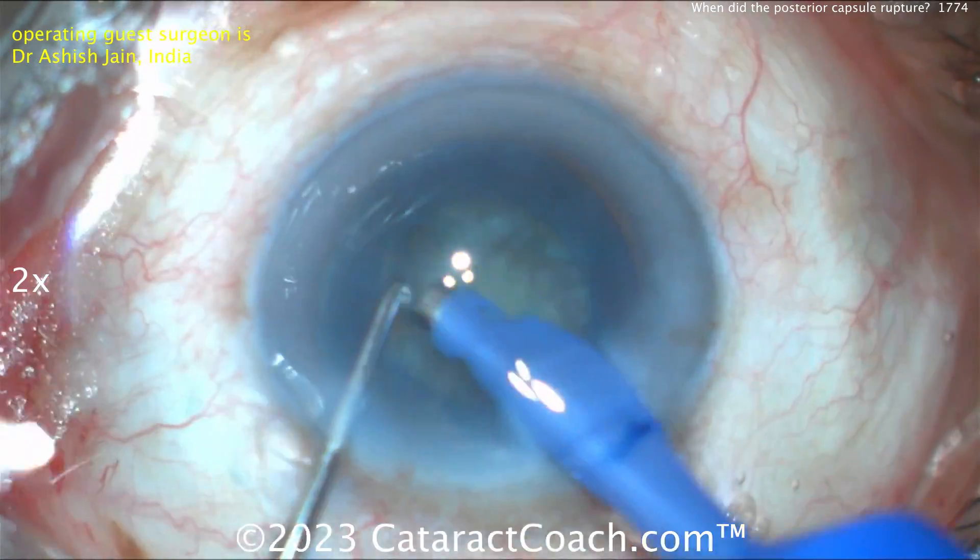Bring up a quadrant, chop it into two smaller pieces, aspirate those down — all looks pretty good. Taking out that little piece, okay. Now only one quadrant left in the bag. Take that down — there's the one quadrant left. Rotate, rotate, rotate, and there's that last quadrant coming up.